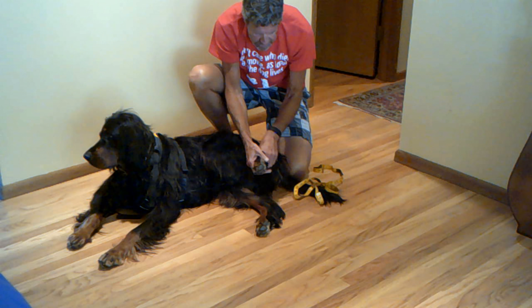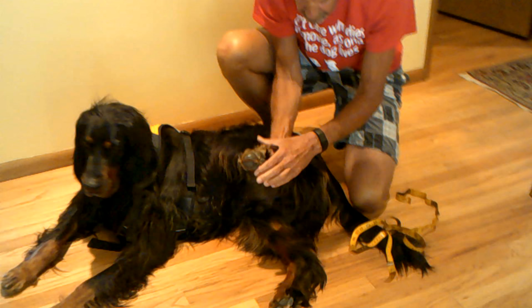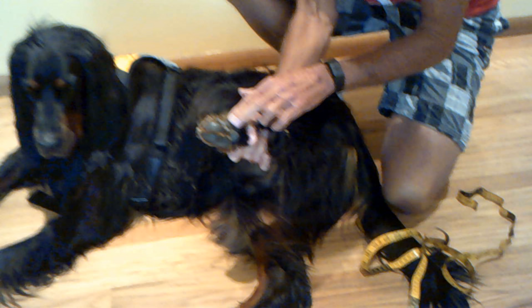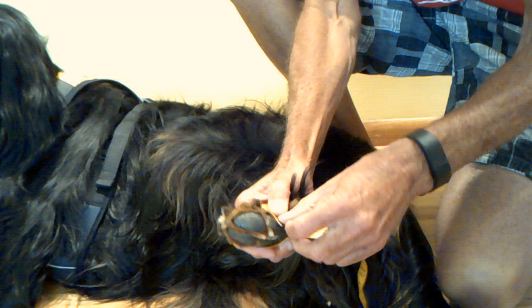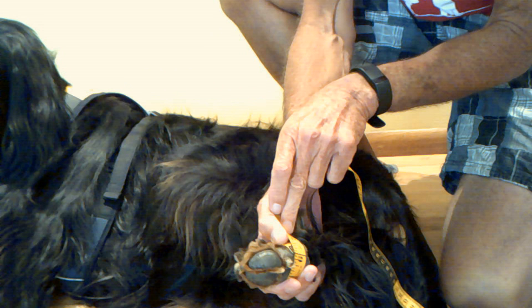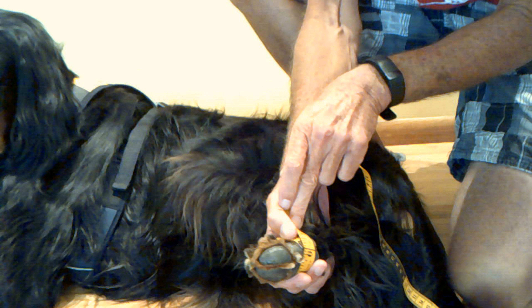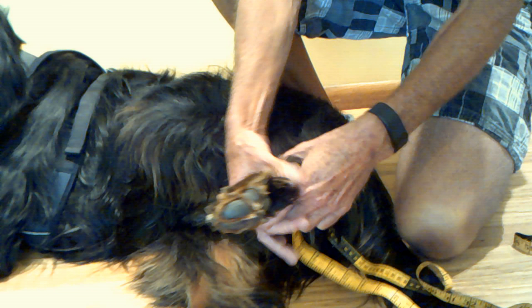The second measurement is of the widest point of the paw. If you run your measuring tape across these two metal pads and around, that will be the widest point of the paw. For Brody that is going to come out to 6 inches — an inch bigger than the lower part of his leg.